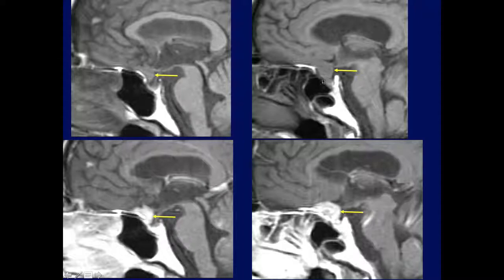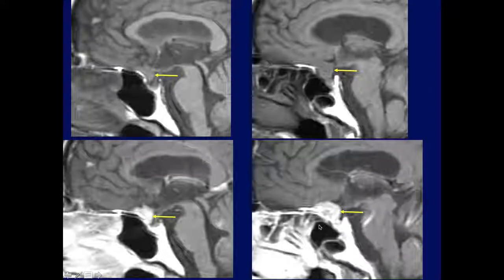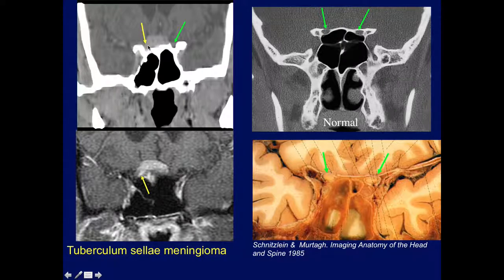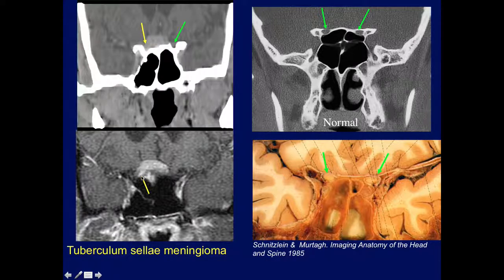Here's another tuberculum sellae meningioma with enhancement. On CT you can see what's happening — here's the tumor, this is the normal left optic canal, but the tumor has extended into the right optic canal. Even though this is a very small meningioma involving the region of the tuberculum sellae, the extension of the tumor into the right optic canal — seen on both CT and MRI — is the critical finding.